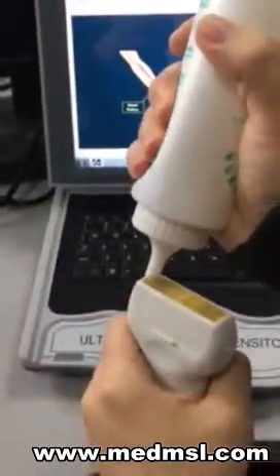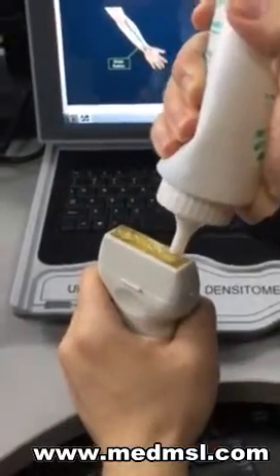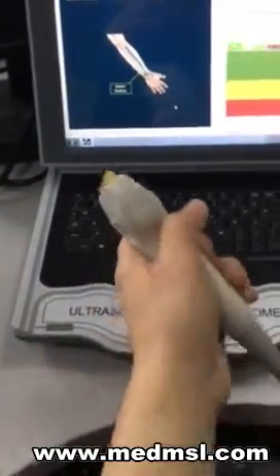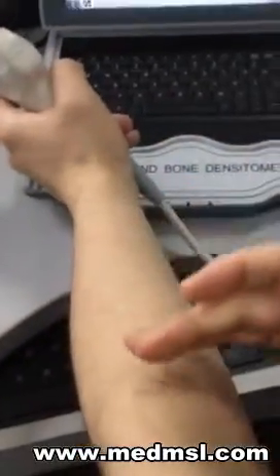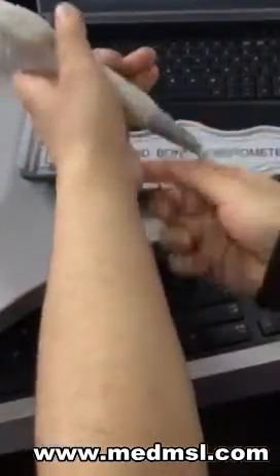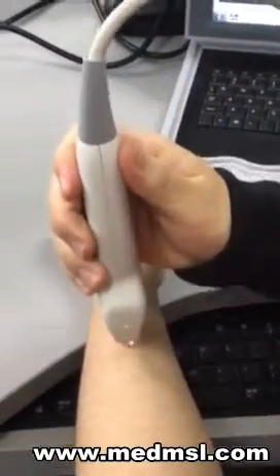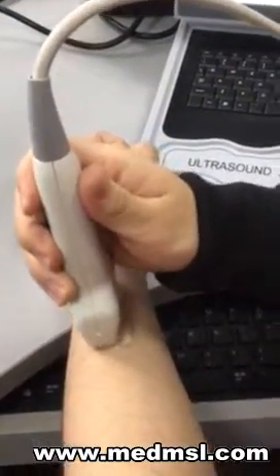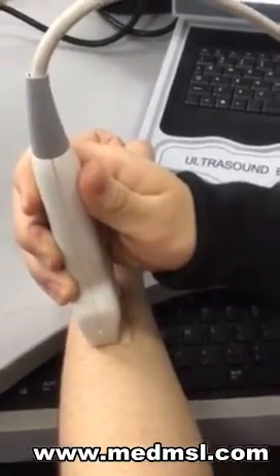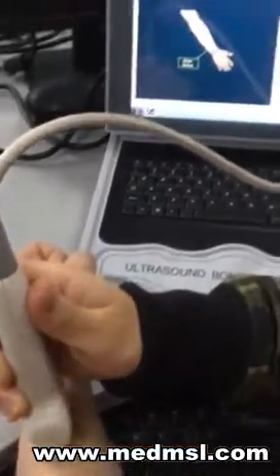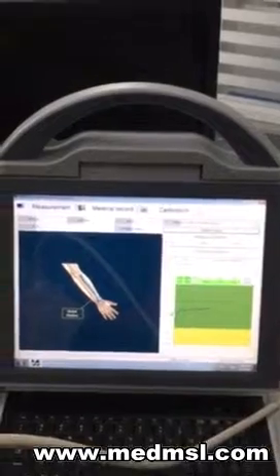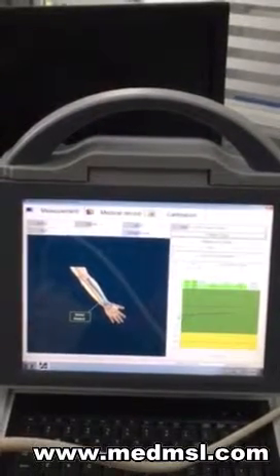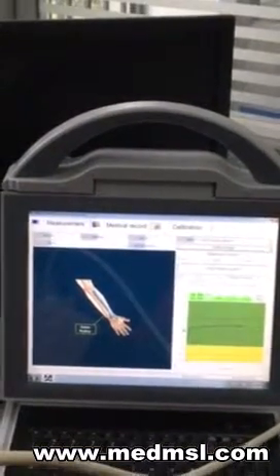Put some gel on the probe. Now is the determination of the left radius position. As the picture shows, put the probe on the radius. The curve will be extended.